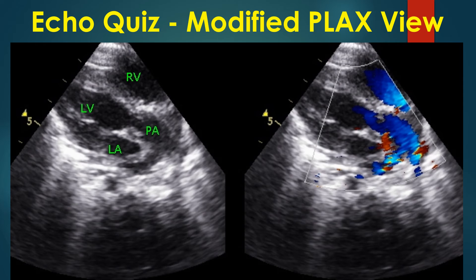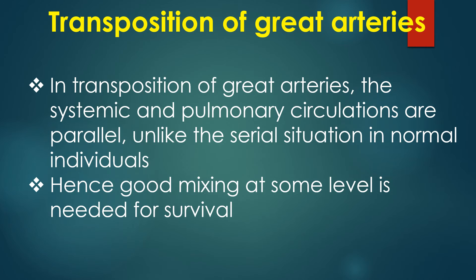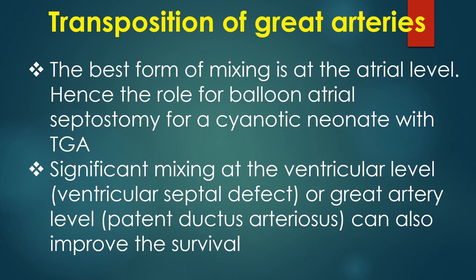Overall, the features were consistent with transposition of the great arteries. In transposition of great arteries, the systemic and pulmonary circulations are parallel, unlike the serial situation in normal individuals. Hence, good mixing at some level is needed for survival. The best form of mixing is at the atrial level, hence the role for balloon atrial septostomy for a cyanotic neonate with TGA. Significant mixing at the ventricular level or great artery level can also improve survival.